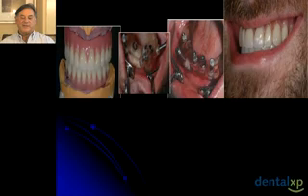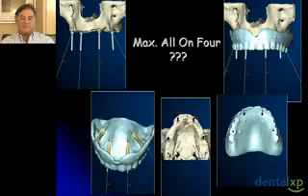Here's a patient that had a class 3 occlusion. They have typically lots of bone in the area, so I had long implants, and I was able to have a nice restoration with an all-on-4 concept. Now, I have the concept for maxillary all-on-4. Do I recommend it? Not necessarily, because the bone in the upper jaw is a little bit softer. We can't get as long implants as we can in the previous case that had tremendous height, but it is a possibility to perform it as well.